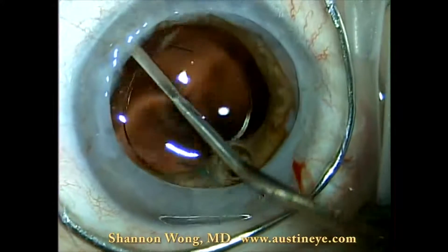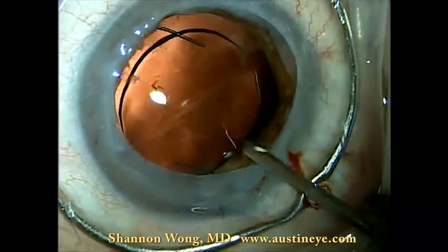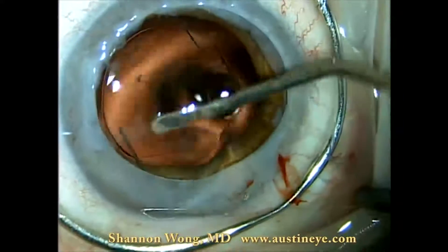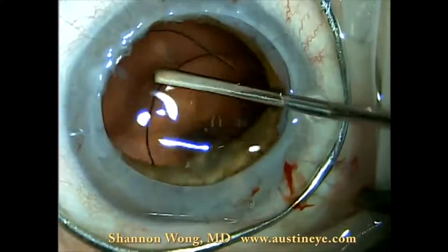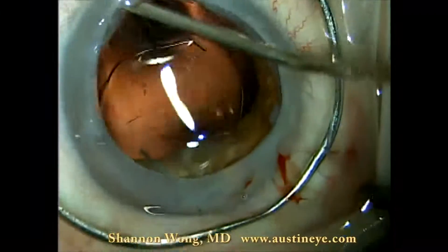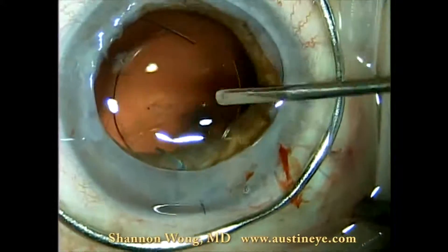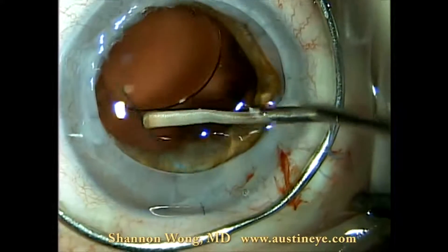We spend a few minutes repositioning this lens from the anterior chamber angle into the ciliary body sulcus. The posterior capsule behind the lens optic is irregular. There is an anterior capsule shelf, but that shelf is ill-defined. We cannot see the full extent of the anterior capsule shelf, so we place the lens in the region where there seems to be adequate support using a collar button instrument.